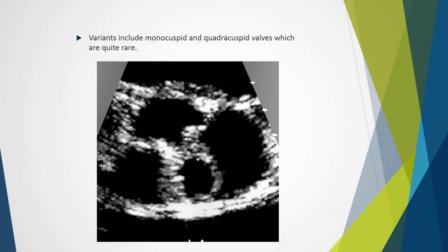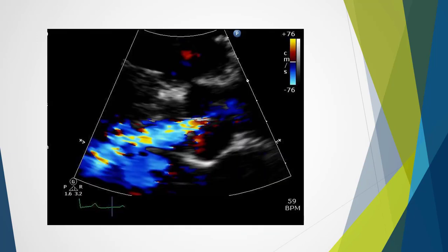Variants include monocuspid and quadricuspid valves, which are relatively rare. In this example of a monocuspid valve, the only actual orifice is visible and everything else is fused. In this instance it all looks fairly benign except for a reasonable amount of aortic regurgitation moving down to the ventricle.